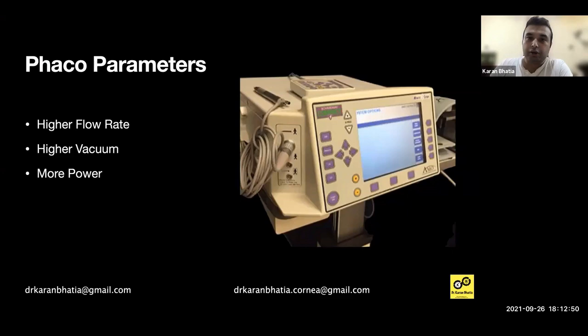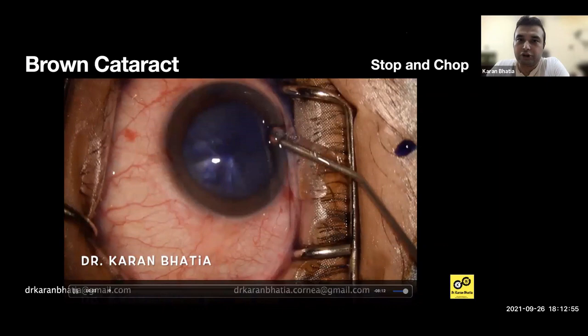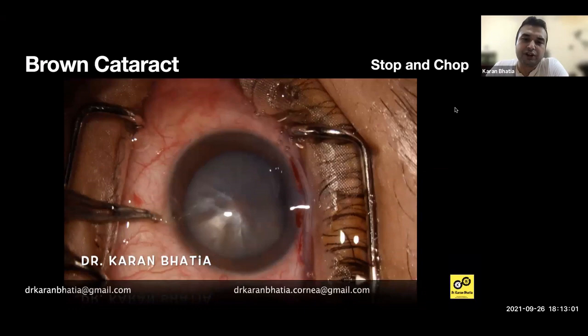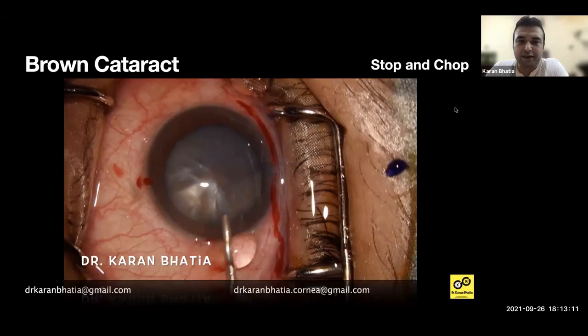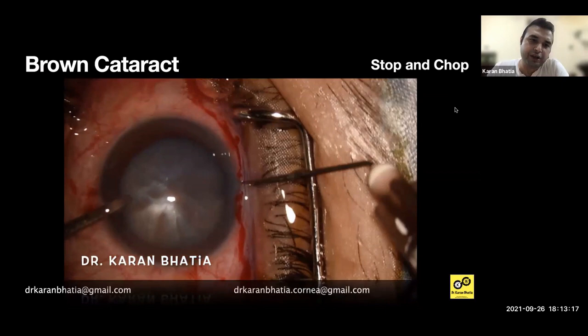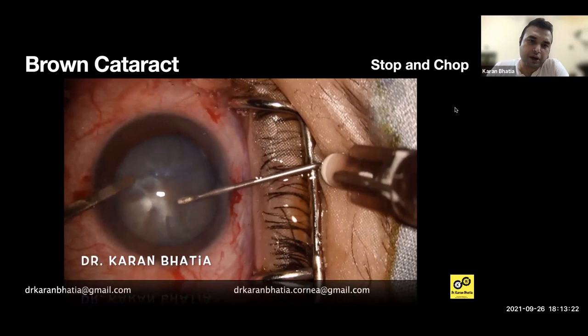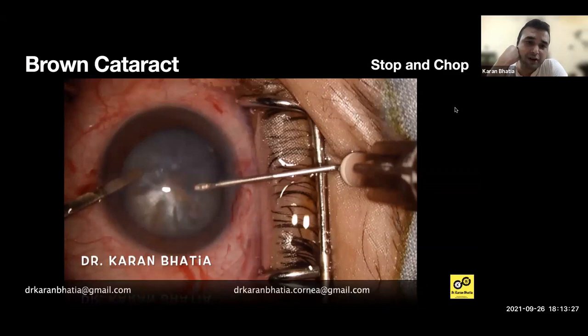Now let's look at some cases. This first case is a stop and chop FACO. After staining, OVD is injected inside the eye. This is a brown cataract. A keratome entry is made, OVD is injected. You can see the lens is slightly intumescent — this is probably a topical case. There is some milky fluid coming in, so you have to be very careful doing the rhexis in such a situation. The rhexis is one of the most important things when you're doing FACO.